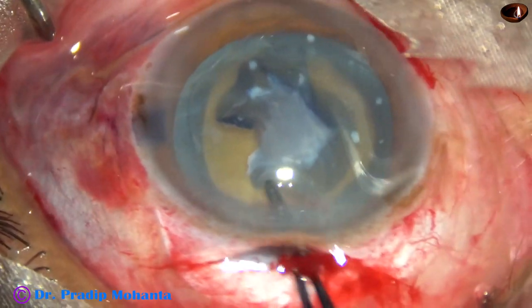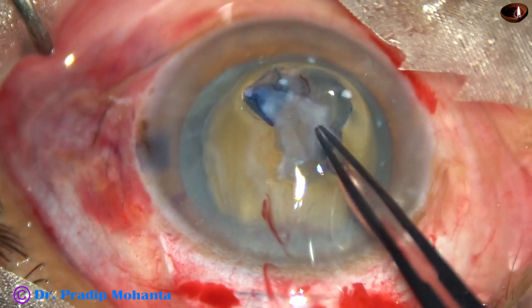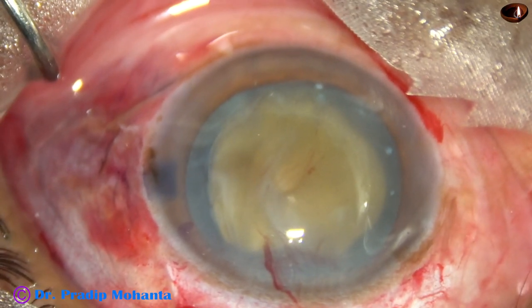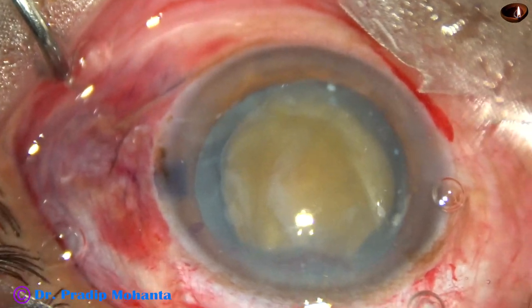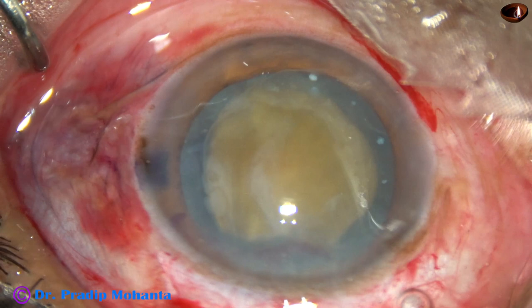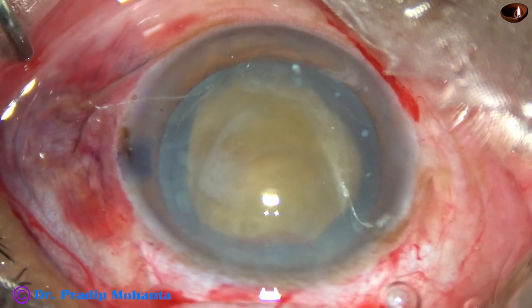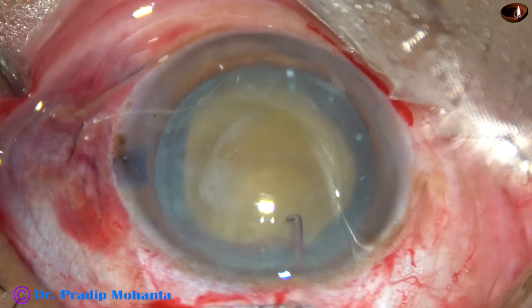Now I am going to remove the capsule, which is fibrous and very thick. You can see — this is the fibrous tissue. Now the nucleus has to be prolapsed into the anterior chamber. Thorough irrigation of the ocular surface will improve visibility. Inject some visco to fill up the anterior chamber. I am going to bimanually prolapse this nucleus into the anterior chamber. Take two Sinskey hooks — one hook goes behind and the other rotates — and it has come out.